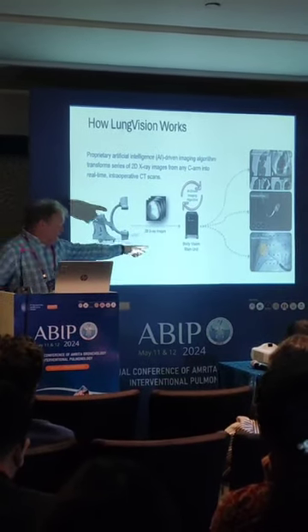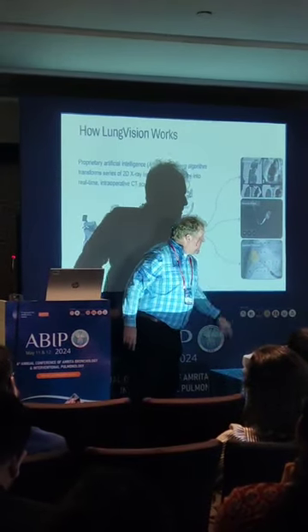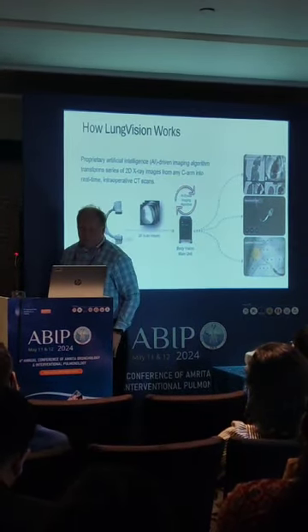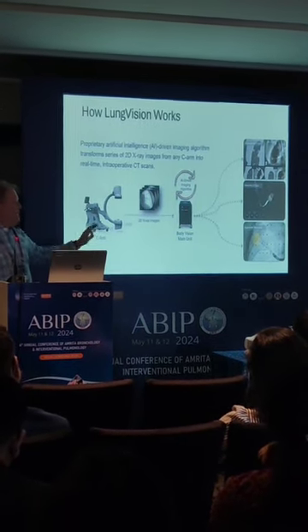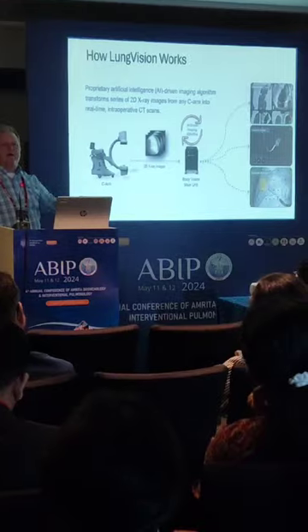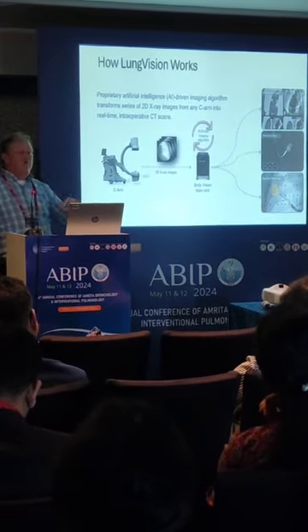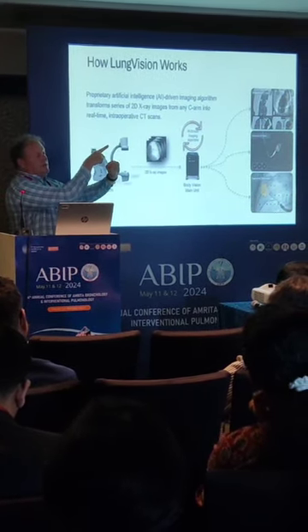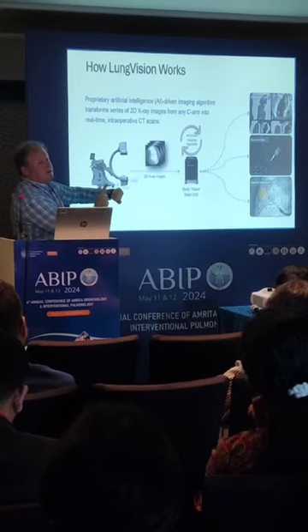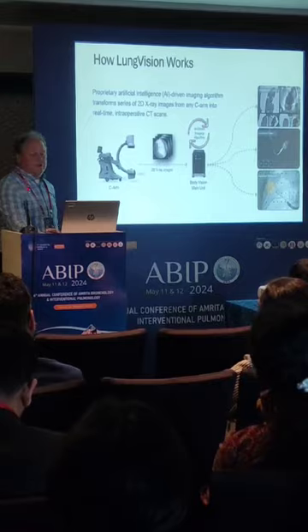And then you get the fluoroscopic overlay, the most important part. And again, in this particular example, the lesion's big enough that you can probably have seen it fluoroscopically. But that yellow ball has been marked by you today, right now, intraoperatively. So that is the lesion. And it looks at LAO and RAO, so you can avoid what Dr. Coe was talking about, where you think you're in the lesion, but you're actually like this. Because remember, you're looking at it like this, or you're behind it, right? And you're busy missing. So let's go through what this means.